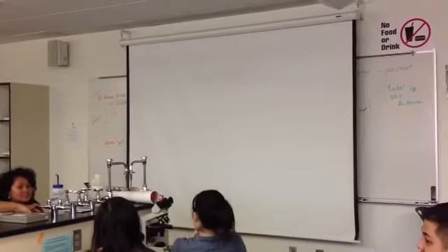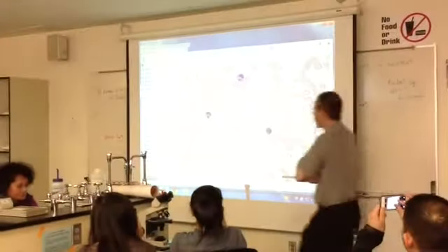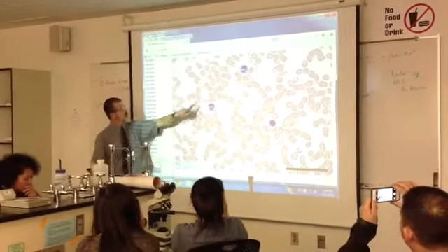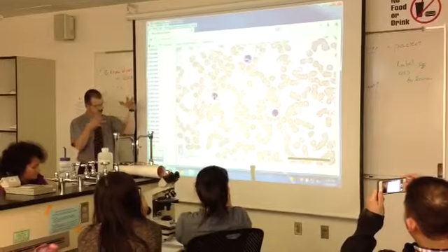Here's the most classic view you'll see in the microscope come next week for your exam. So you're going to look at that and say, Mr. Christie, what do I see? First thing you're going to identify are these. Red blood cells, erythrocytes. Then you identify these. Platelets, those are the easy ones. Then you got the white blood cells you have to identify further.